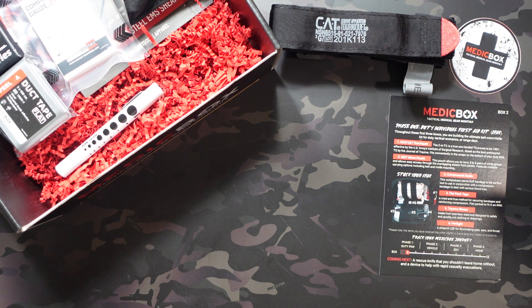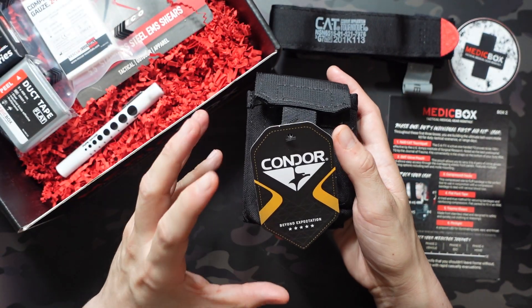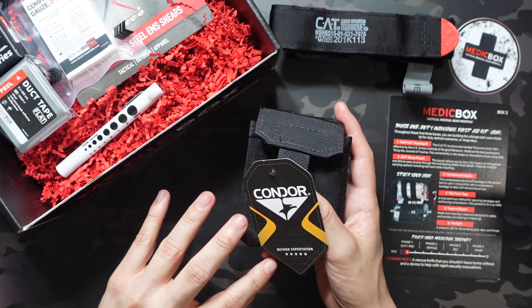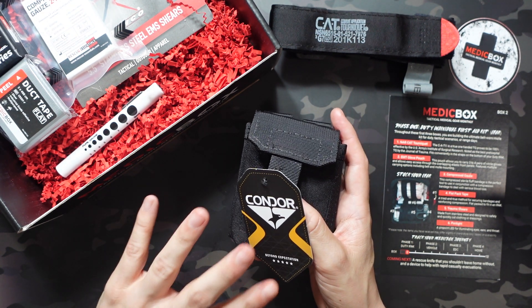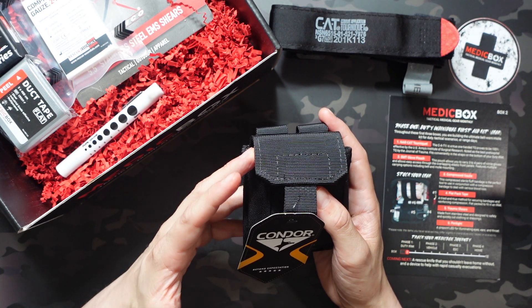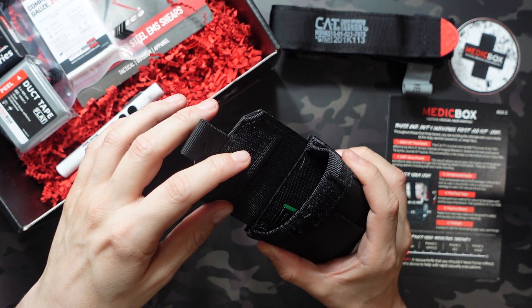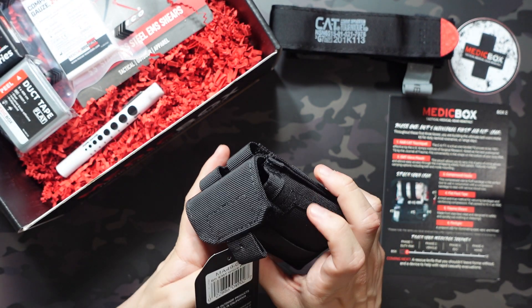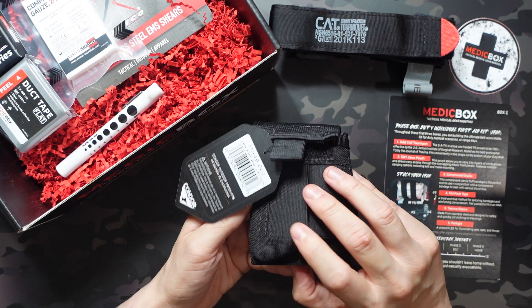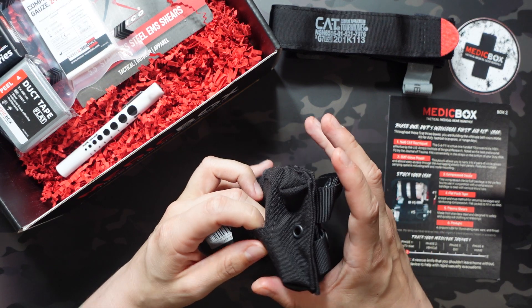Next up we get an EMT glove pouch from Condor — a very well-known brand that makes tactical pouches and bags. This is exactly what it sounds like. Velcro on top allows you to put three to four pairs of nitrile gloves in there. You don't need to open it to access them in the field — there's a small opening so you can reach in and pull those out for quick access. There's also a drainage hole on the bottom so any moisture should drain right out.